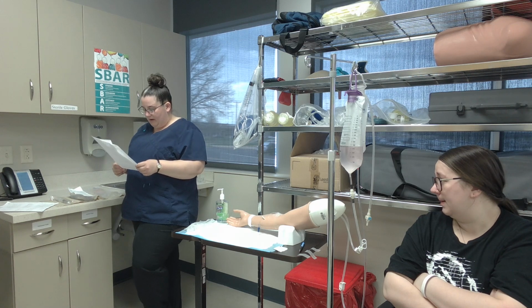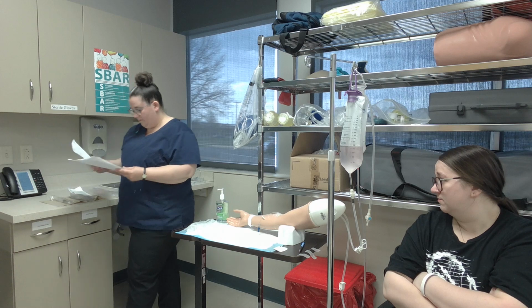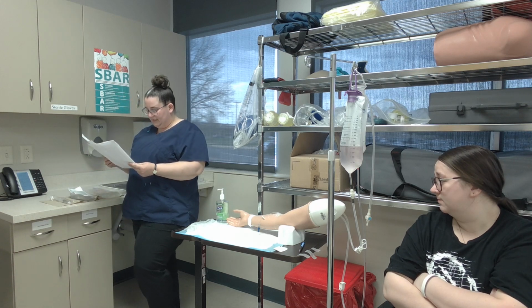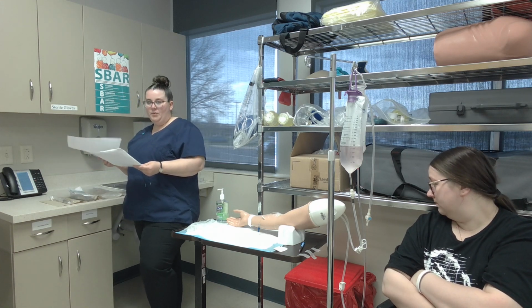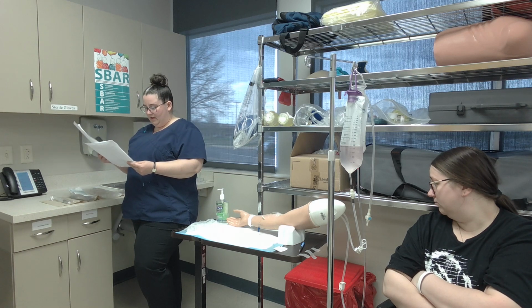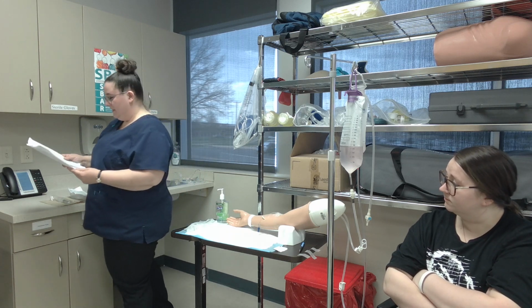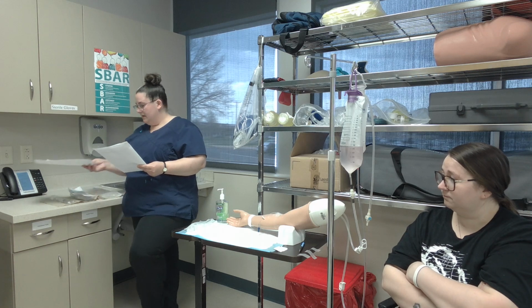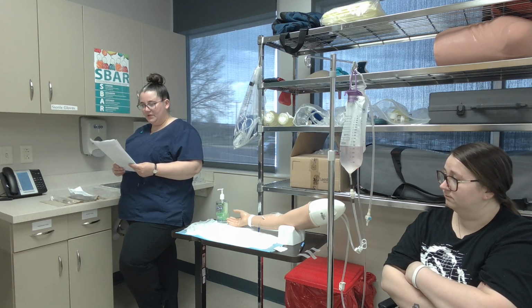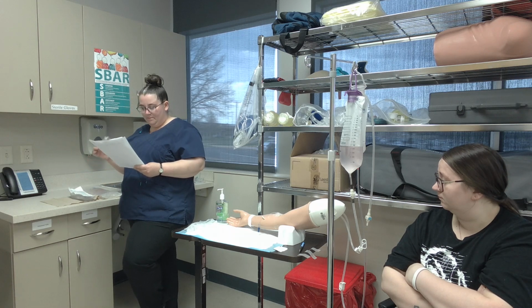So I have everything ready, and the amount of medication I will be giving for the normal saline is 100 ml per hour, 25 drops per minute. So that is for my first med check. I'm going to continue to my second med check. So I have Mr. Joseph Smith, 10/5/1954.